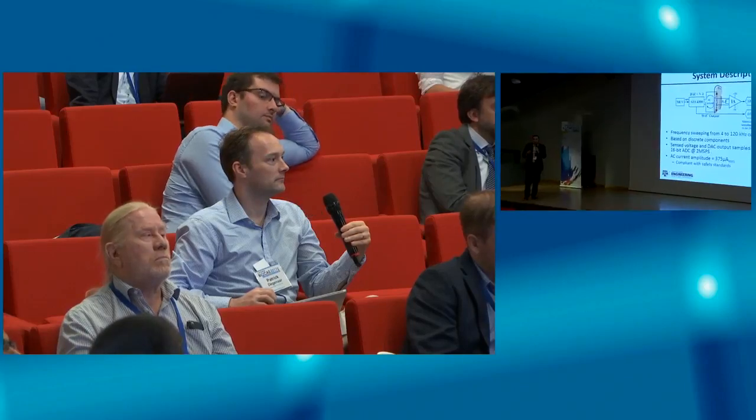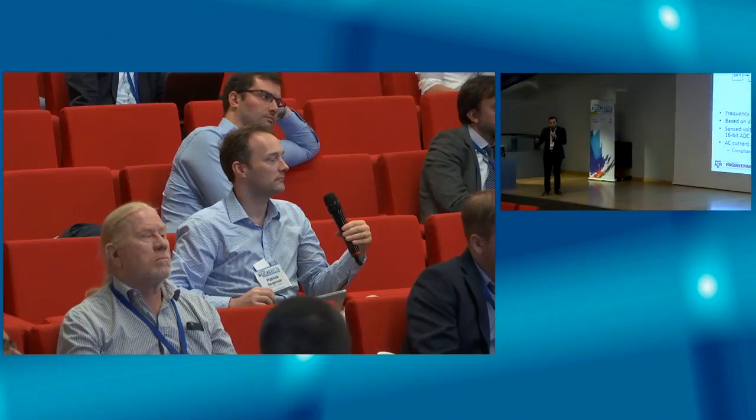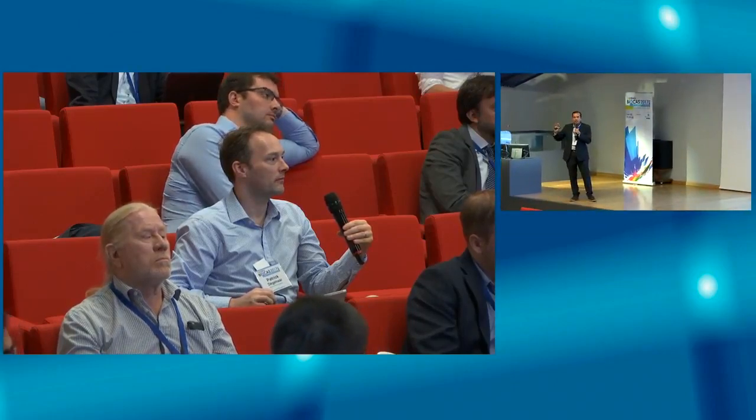There will be motion artifacts, and a lot of problems affect the bioimpedance. There is a lot of work in literature to solve the problems of motion artifacts, but we believe that you can still solve these motion artifact problems, and also you can detect that you are at rest and get these useful measurements when you are at rest, using, for example, IMUs to detect when you are moving or when you are at rest.